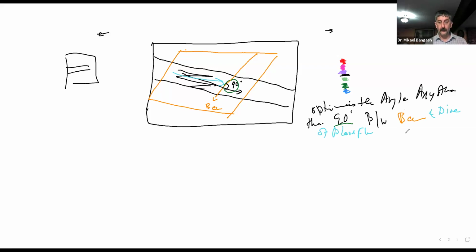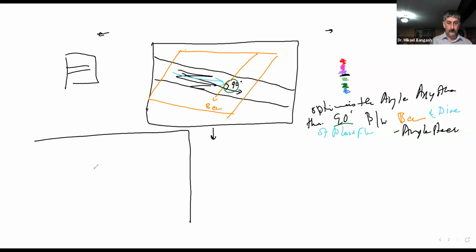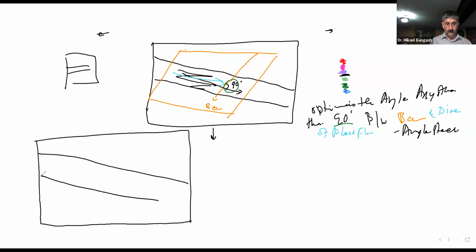Well, again, still by an angle steer. So, students, this is the one where, if first this here was the blood vessel, and now your angle is like this, you can say that this is not a 90-degree angle.